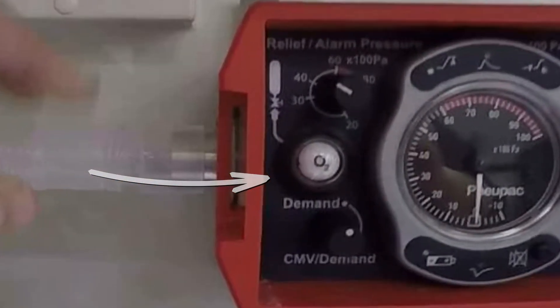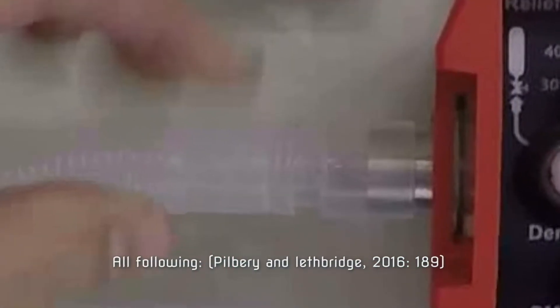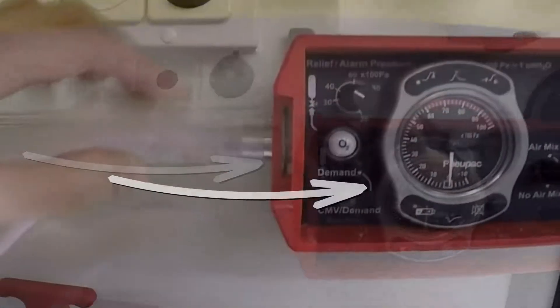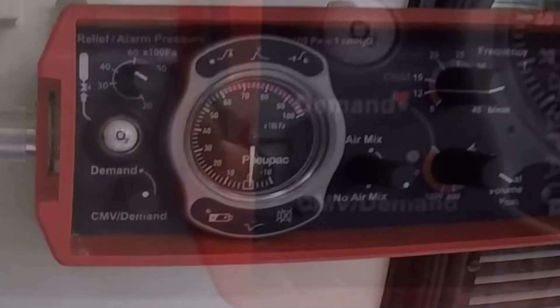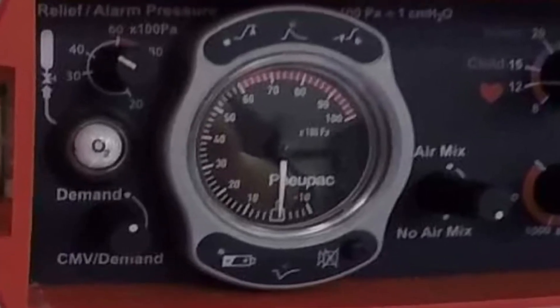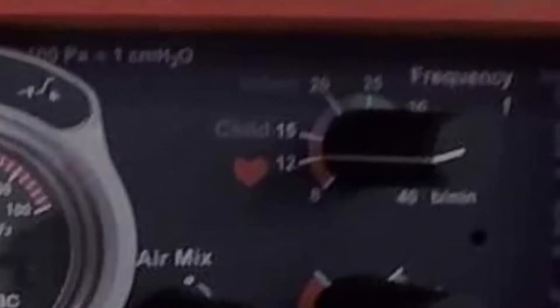Here are the useful parts: the supply gas failure alarm, the inlet connection, the relief pressure control, the main pneumatic switch, air mix control, inflation pressure monitor, frequency control, and the tidal volume control.